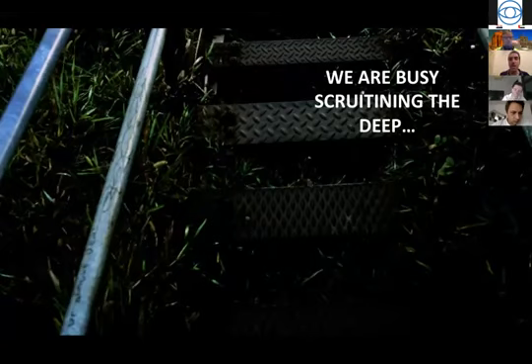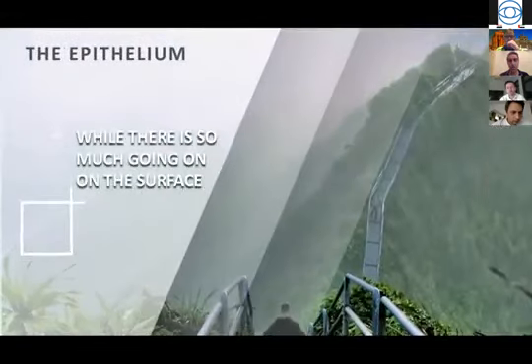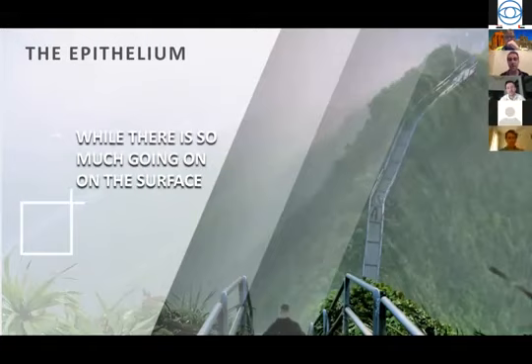Now, we've been looking all the time over the past few slides at everything that is deep, but it's nice sometimes to see that OCT now shines in something that is much more superficial, all the way up, and that's the epithelium. So while sometimes we go search for the nitty-gritty details, especially in keratoconus and our post-refractive patients on the posterior float, we forget sometimes how deep of an impact the epithelium has on our overall tomography.